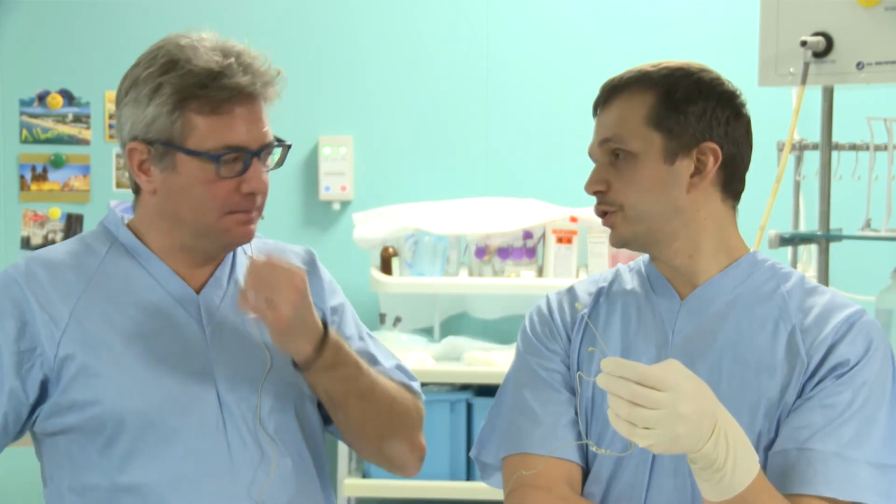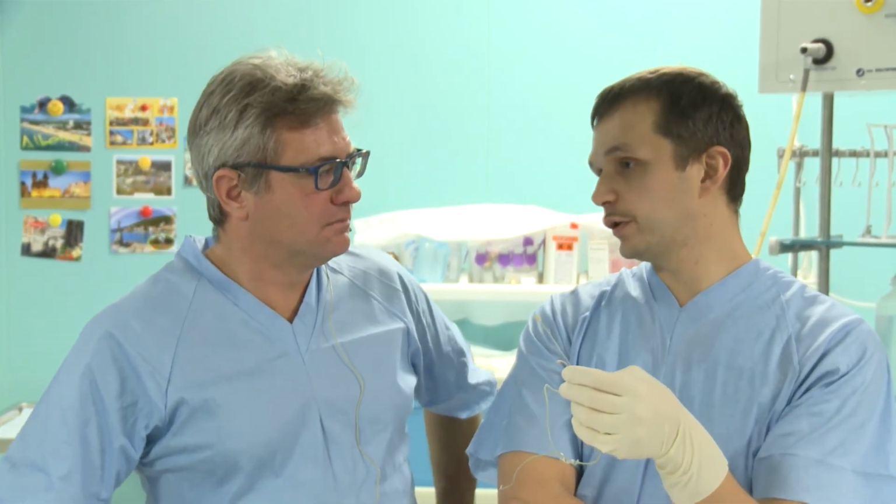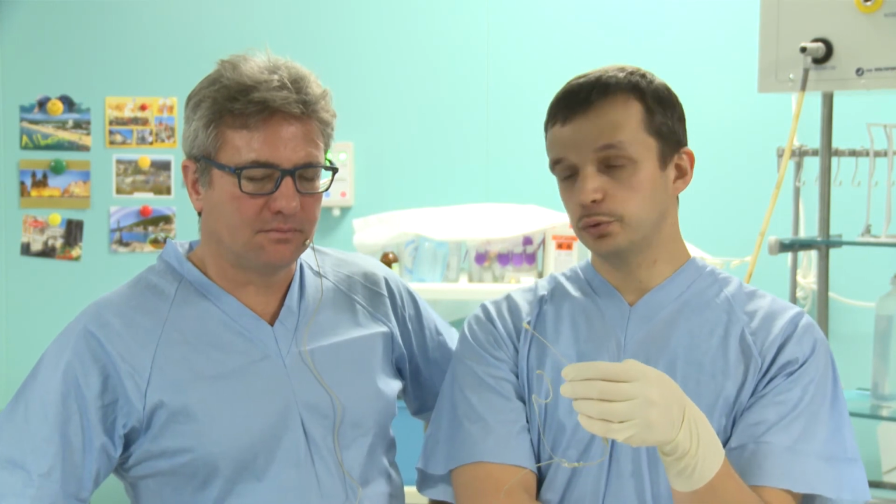I would like to ask a question in this clinical setting. Maybe we should study the liquid we obtain to see the amylase concentration, to understand if it's a true pseudocyst, if the amount is more than 1,000 units, or if there is no amylase, it allows us to exclude the pseudocyst completely.